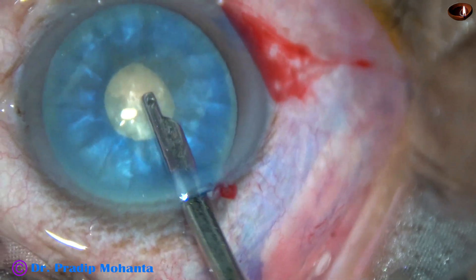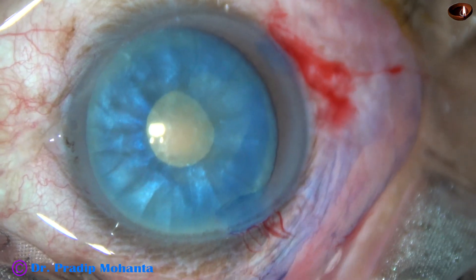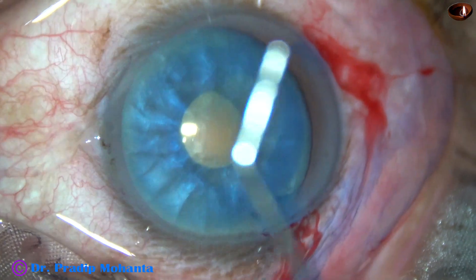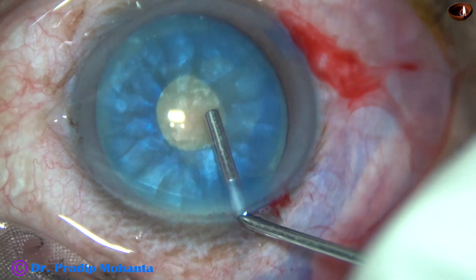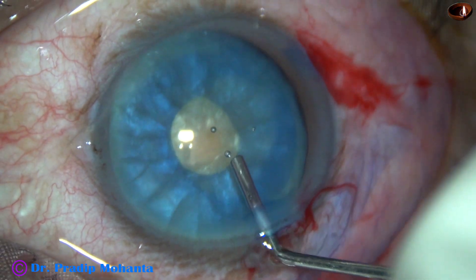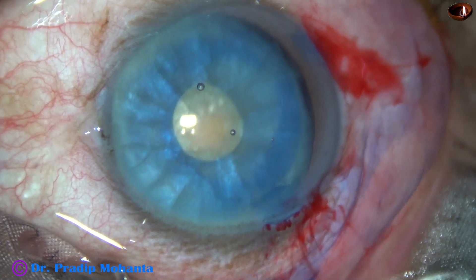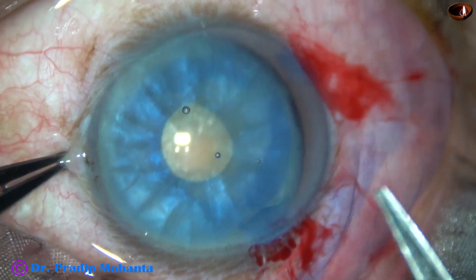But we should not apply stress on the margin of this mini-rhexis. With a lot of stress, this mini-rhexis can also get torn. Now, a lot of visco is injected. The anterior capsule becomes almost flat because the intralenticular pressure has reduced.